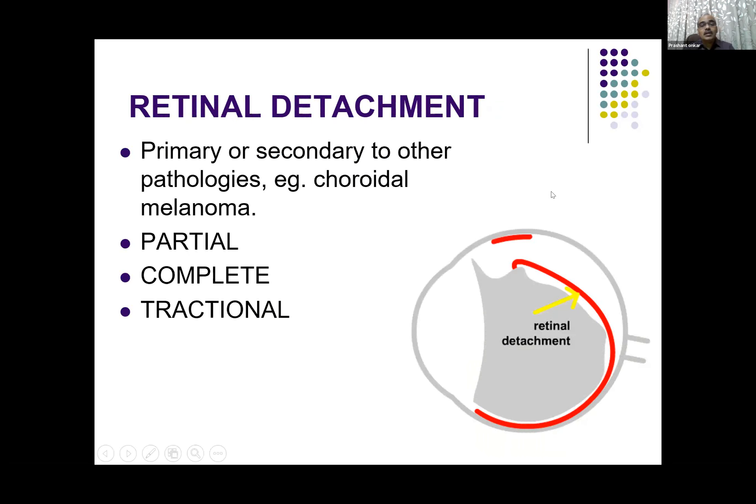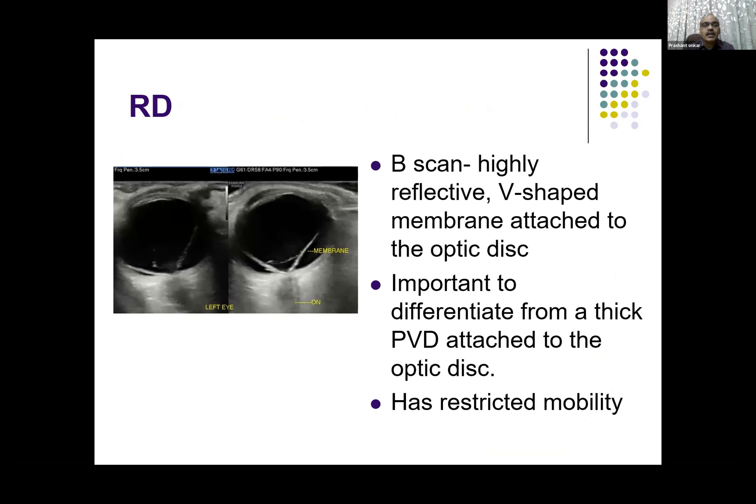Next pathology that presents acutely is retinal detachment — it can be primary or secondary, and it can be partial, complete, or tractional. The complete retinal detachment is very highly reflective, is typically V-shaped, and is always attached to the optic disc. That is the way you differentiate between posterior vitreous detachment and retinal detachment — the vitreous is thin, the retina is thick, and the retina is always attached at the optic disc.